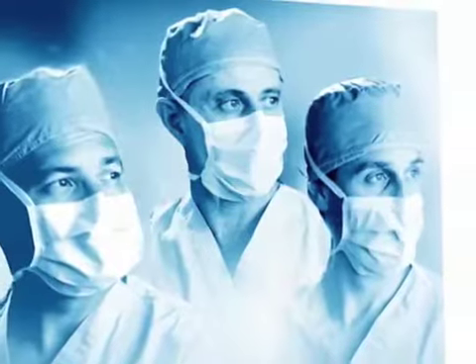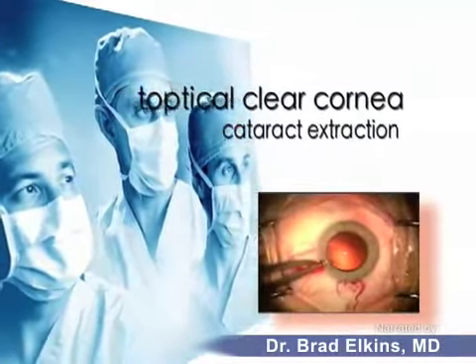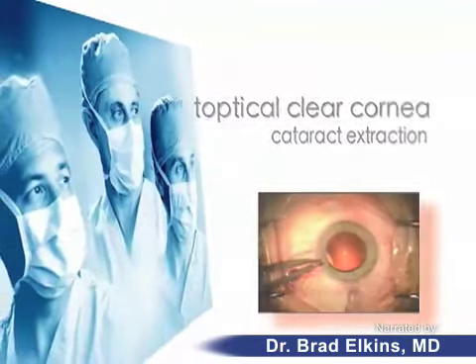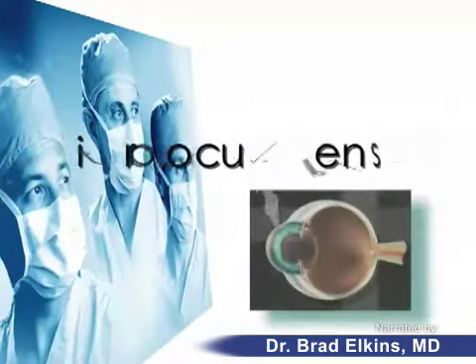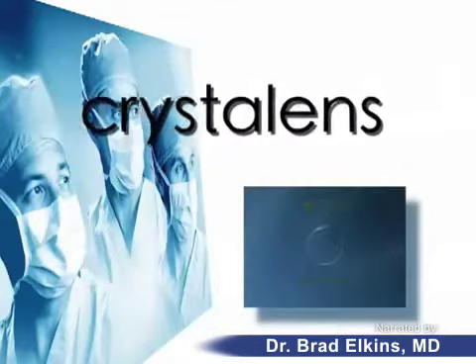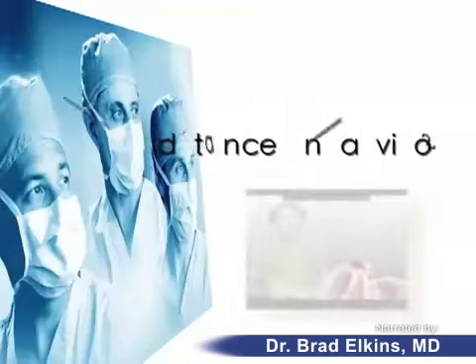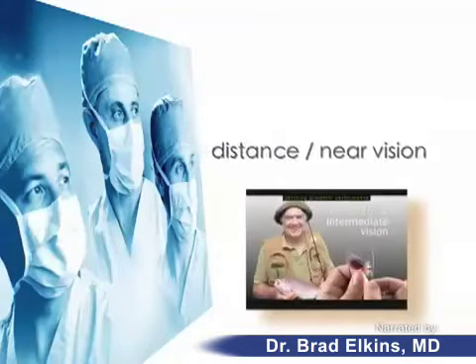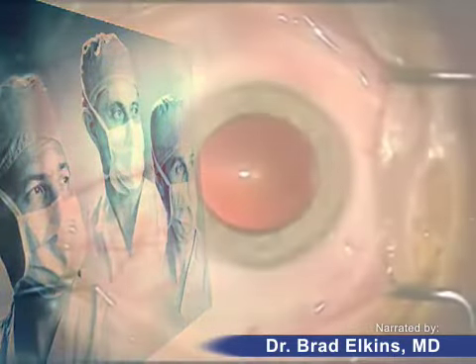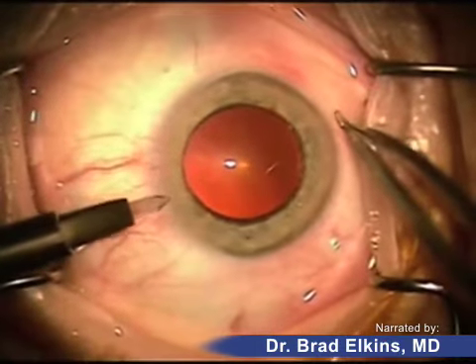This is a topical clear corneal cataract extraction where we're going to remove the cataract and then implant an intraocular lens. This particular lens is a crystal lens, which is an accommodating intraocular lens that gives patients distance vision simultaneously with near vision. The surgery is done under topical anesthesia and the patient cannot feel anything being done.